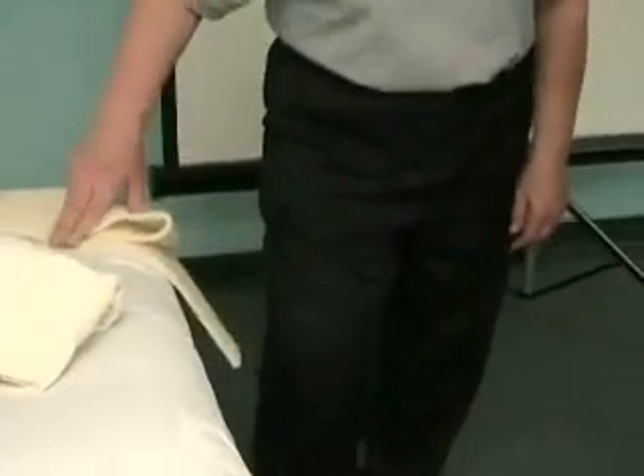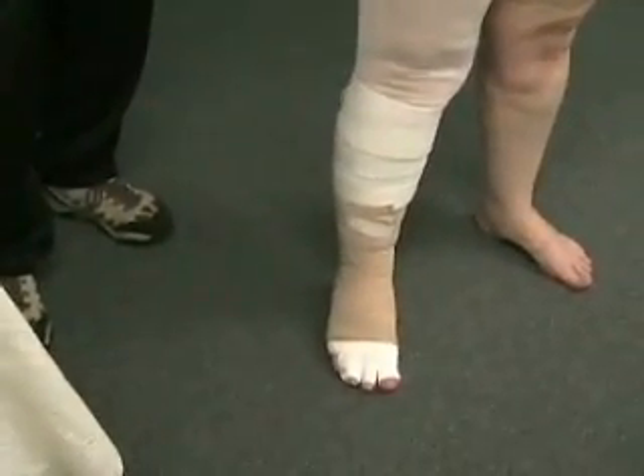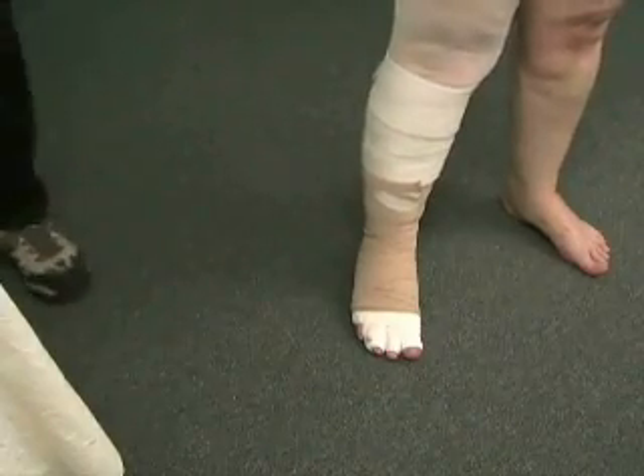How does that feel? That feels really comfortable. So now I'm secure — as long as her foot's comfortable, the rest is a piece of cake, believe me. This is the most critical part. If you keep bandaging without asking how that is when she's actually walking and moving, then afterwards you're going to have to undo that.